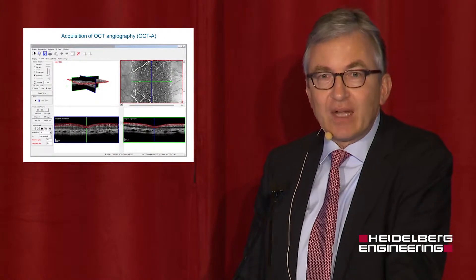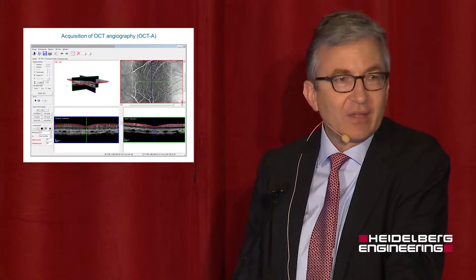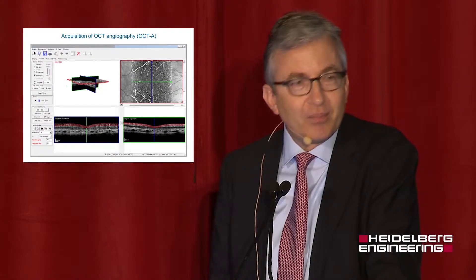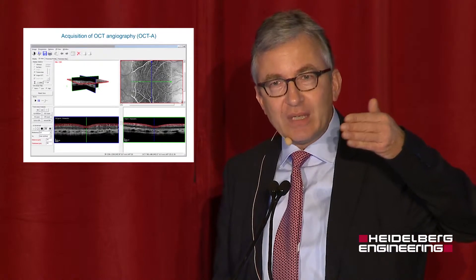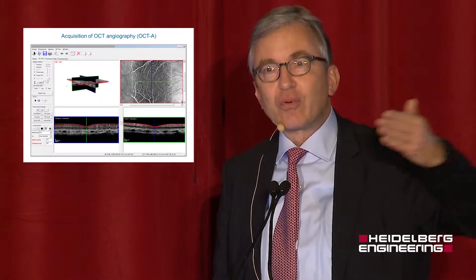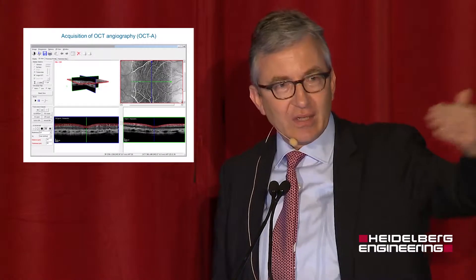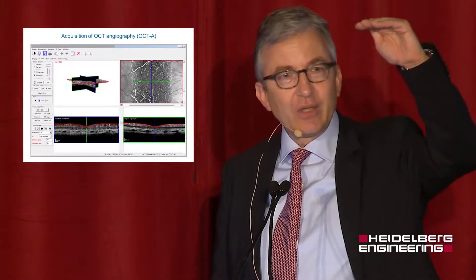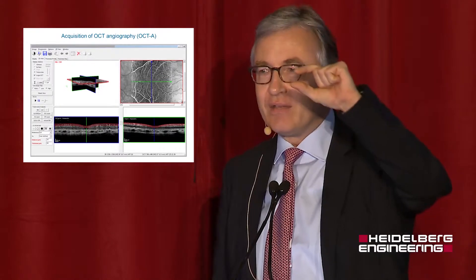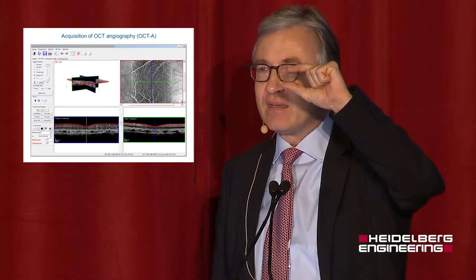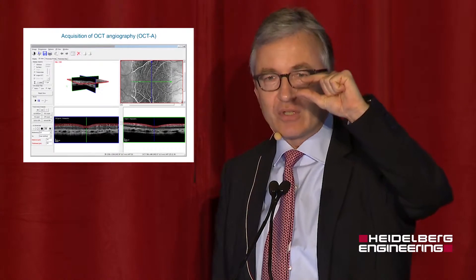Here with the Spectralis instrument, we have learned and seen already beautiful images. We are used in the B-scans to scroll basically horizontally, but now we do the scrolling vertically and can define the vertical dimension of our slab.